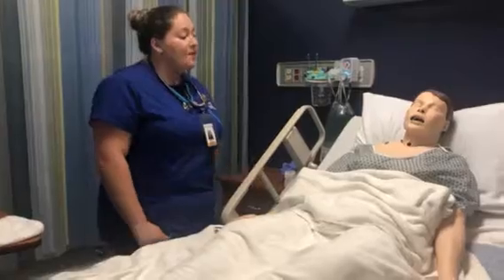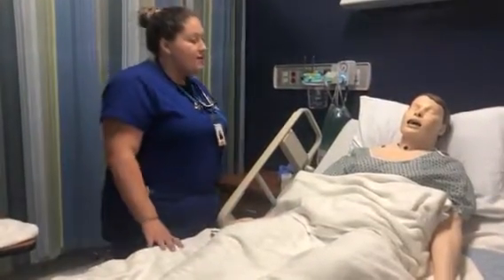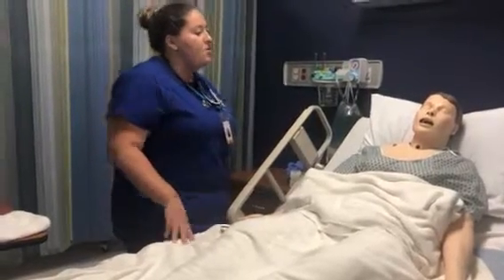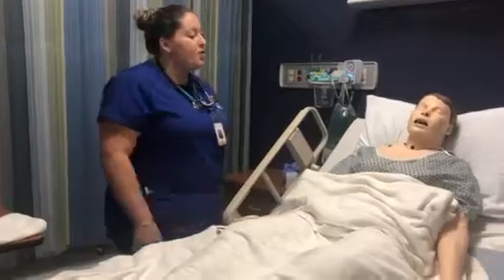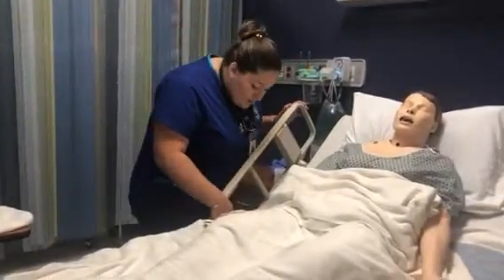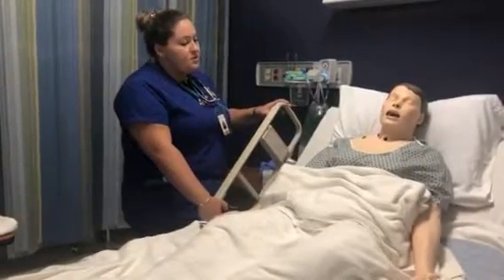Are you in any pain right now? No? Okay. Any nausea or vomiting? No. Okay, and have you had any recent nosebleeds? No? Okay. Any recent nasal trauma or injury? No? Okay. So now I'm just gonna raise the bed to high Fowler's. Gonna put Mr. Smith in high Fowler's position.